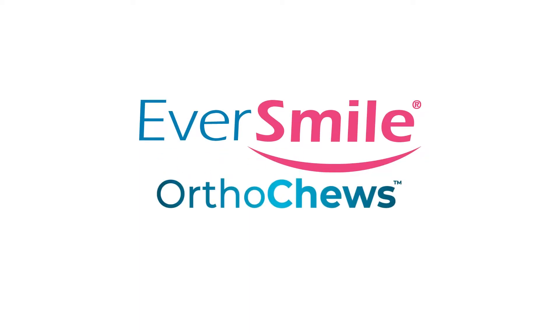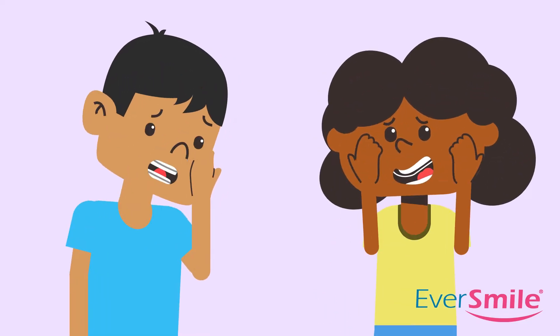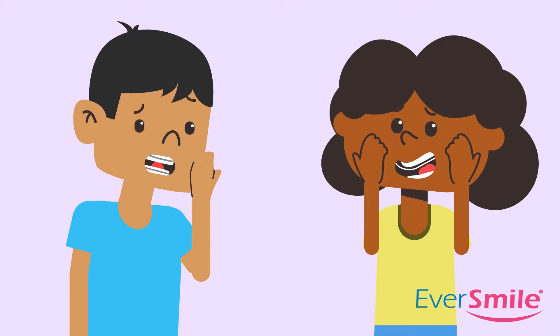Wearing orthodontic clear aligners and braces can be painful, especially after an adjustment or switching into a new set of trays. With OrthoChews, patients can help alleviate this discomfort as needed.